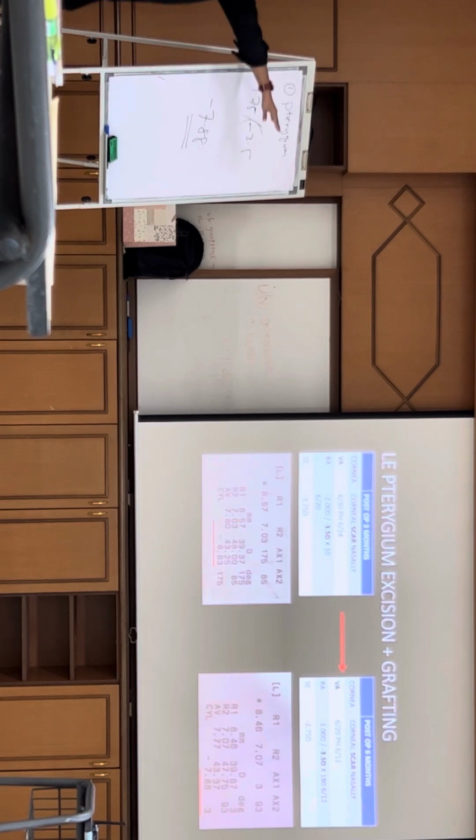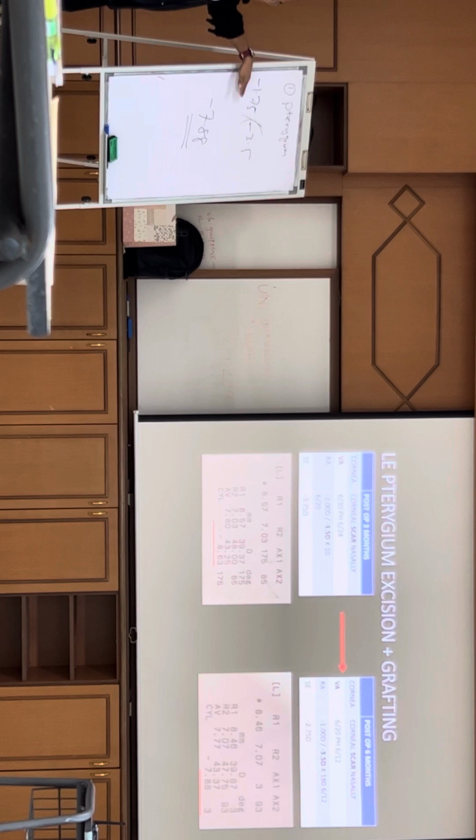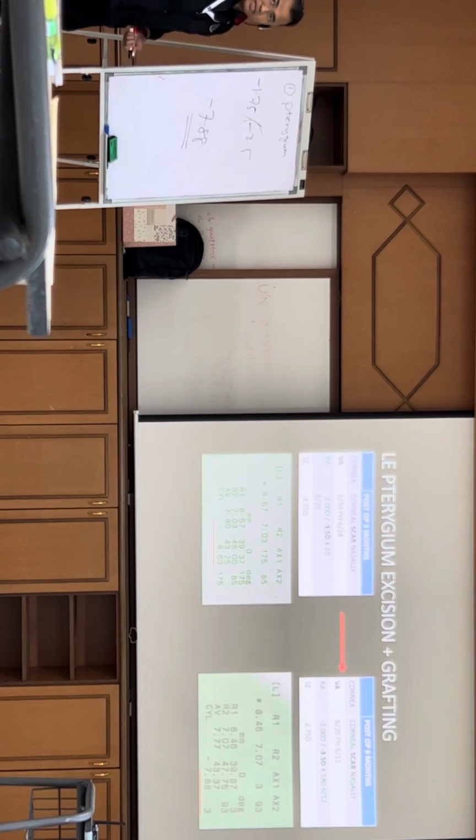So, this is after Dr. Akmal basically removed the pterygium nicely. Now, you look at the astigmatism, the corneal astigmatism has reduced into half, from minus 14 to minus 7.88. Now, that particular pterygium as a flap has been removed, above minus 7 of the astigmatism. That one you understand, eh?